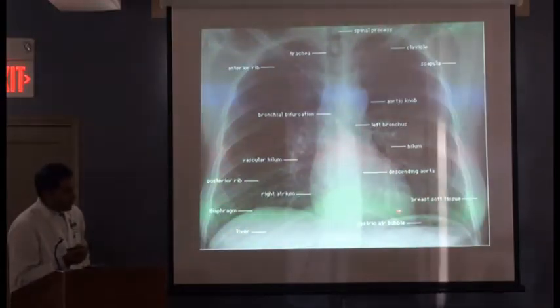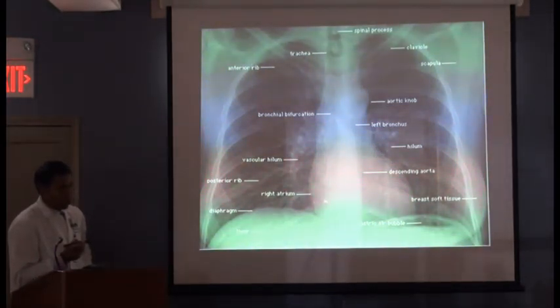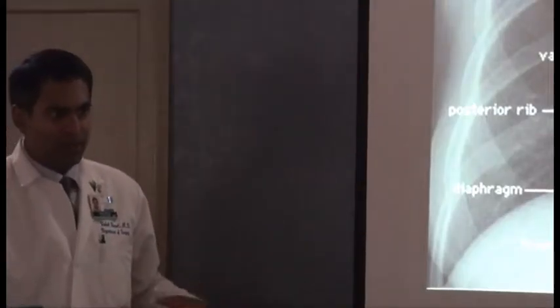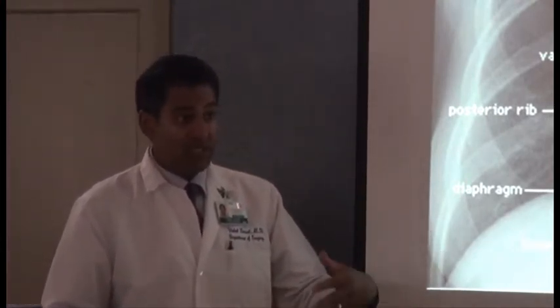So obviously the heart. Now, what do you think? Okay, let's say the heart was huge. All right, what could that be on a chest x-ray? What if the heart's just massive? What could be going on there? Right, one thing is just cardiomegaly, that it's an older patient, it's just a big heart.